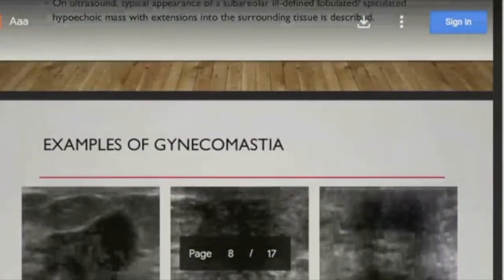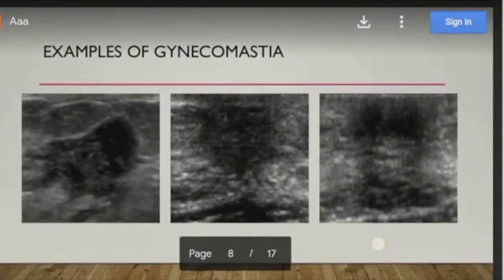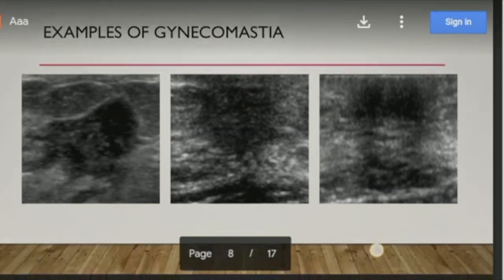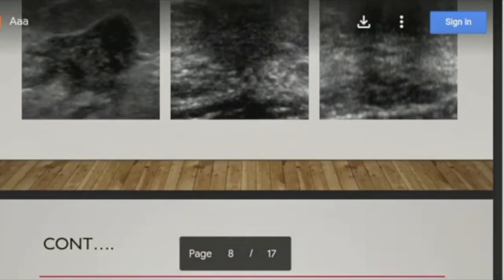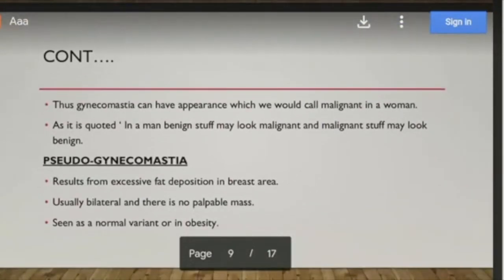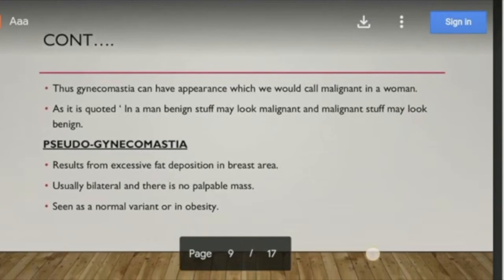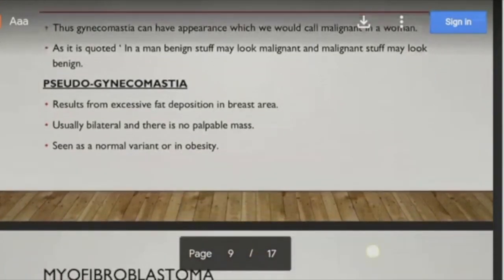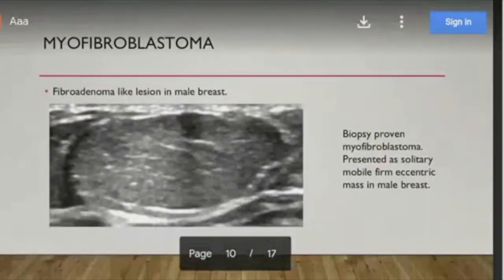Examples of gynecomastia show a hypoechoic mass with spiculations or ill-defined irregular margins. It is usually bilateral. Such a characteristic lesion in women is usually considered malignant, but in males it is usually gynecomastia, provided it is bilateral and subareolar, and is usually soft and tender. Pseudo-gynecomastia is a deposition of fat in an obese man and is also usually bilateral.